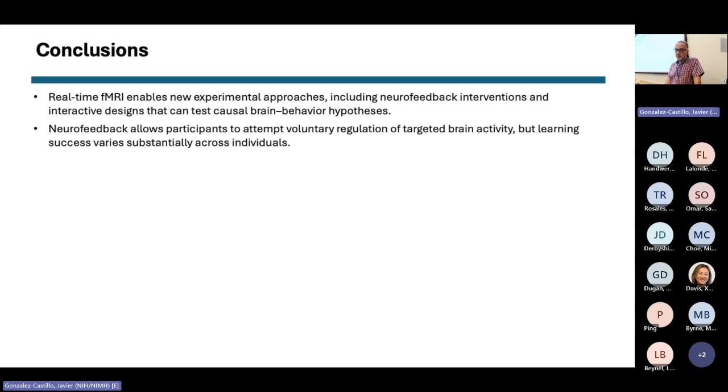Some people are trying to see whether there are some tests that you could do beforehand to actually select your population. There is some study that shows, I believe, that the higher the activity in the target ROI, the more likely that people will be able to control it under completely different conditions. But again, all of these studies are a small population, but that's something that's interesting. Saying, okay, if I know I'm going to have a lot of variability, can I decrease my 40% fail rate to just 10% by doing some tests before?